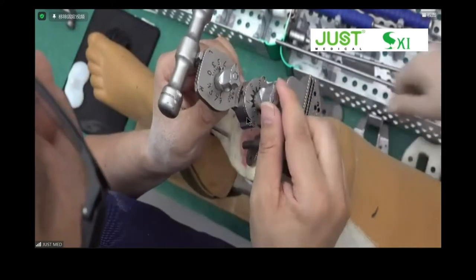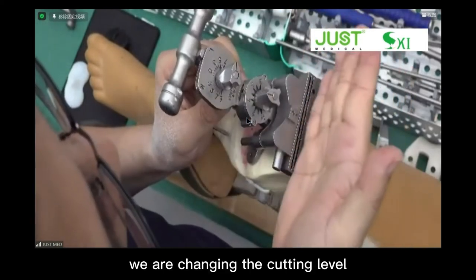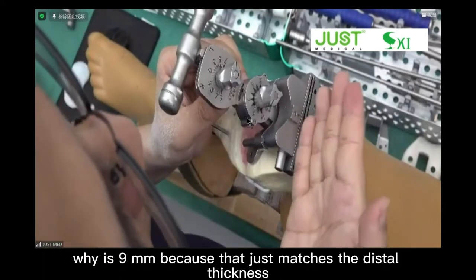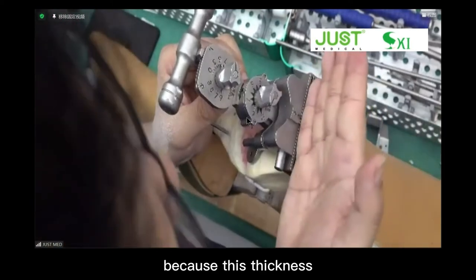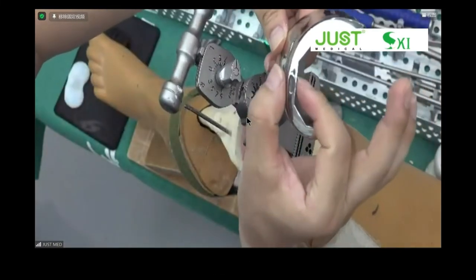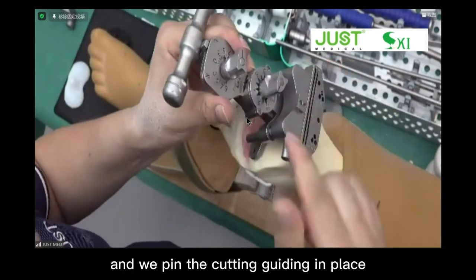And for the depth, the standard distal resection is 9 millimeter. By turning here, we are changing the cutting level. The standard resection is 9 millimeter, so we set it at 9. Why 9? Because that just matches the distal thickness of our SK1 implant. This is the final implant, the thickness is 9. That's why we choose 9 here, to cut 9. So we are resting on the condyles, and we pin the cutting guide in place.